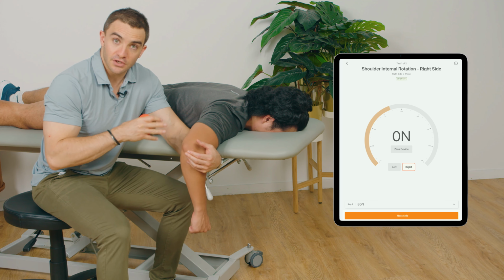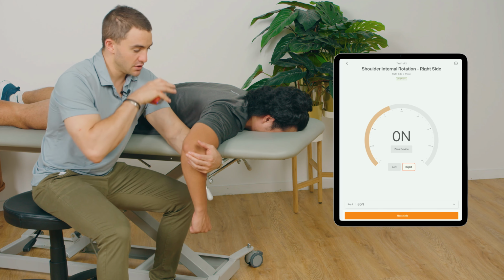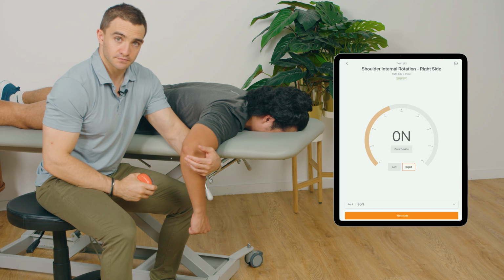Now, again, in the last video, we looked at testing in neutral. It's harder to test in neutral in this position, but I feel like once we progress to 90 degrees, we've got a good amount of control, and then I can flip around and do the same thing for external rotation.